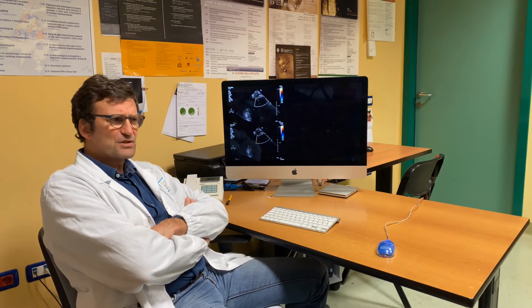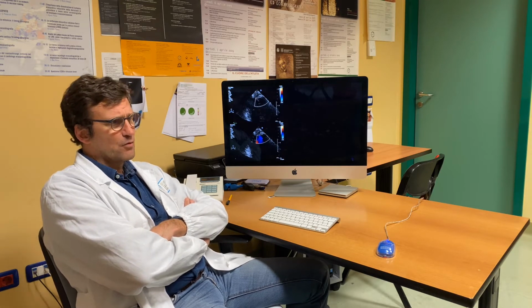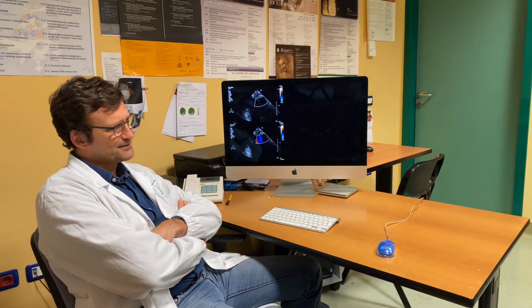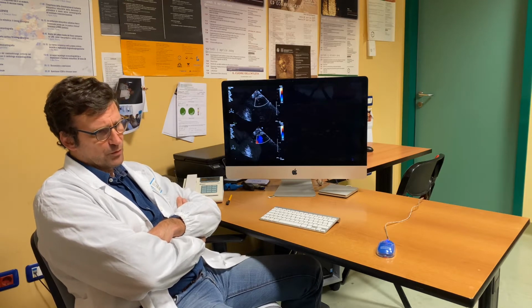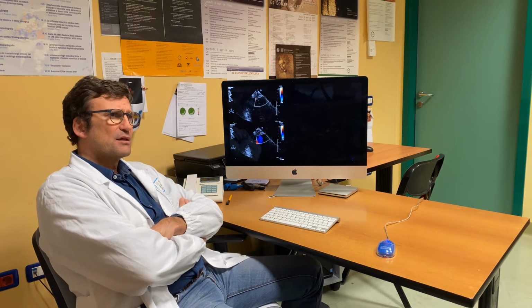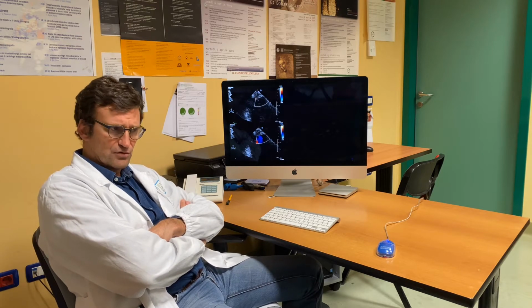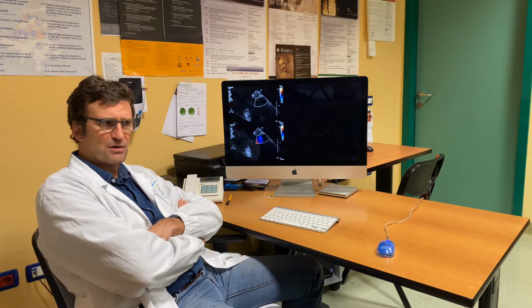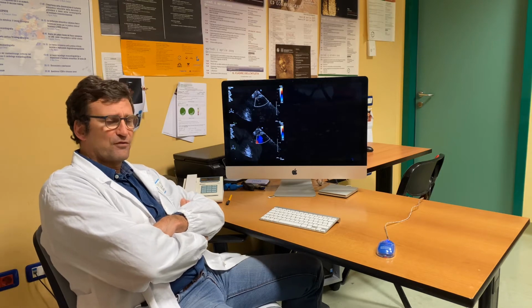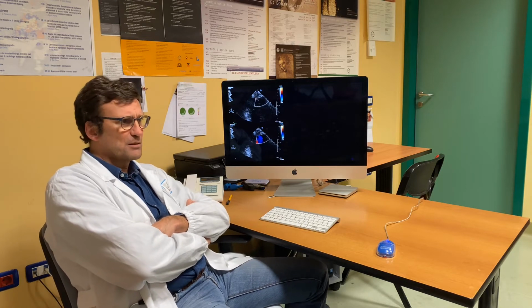It also looks like an underperformed measure. I don't know exactly why. It appears to be kind of a geographical assessment. Maybe in Europe we use it quite a lot, while it's not used in the US. But anyway, the key to the measurement of CFR is that it can be measured without contrast. If you're a skilled professional, you can do this, quite easily actually. But if you're not so proficient in this method, you can help yourself with contrast. Contrast makes it very easy.